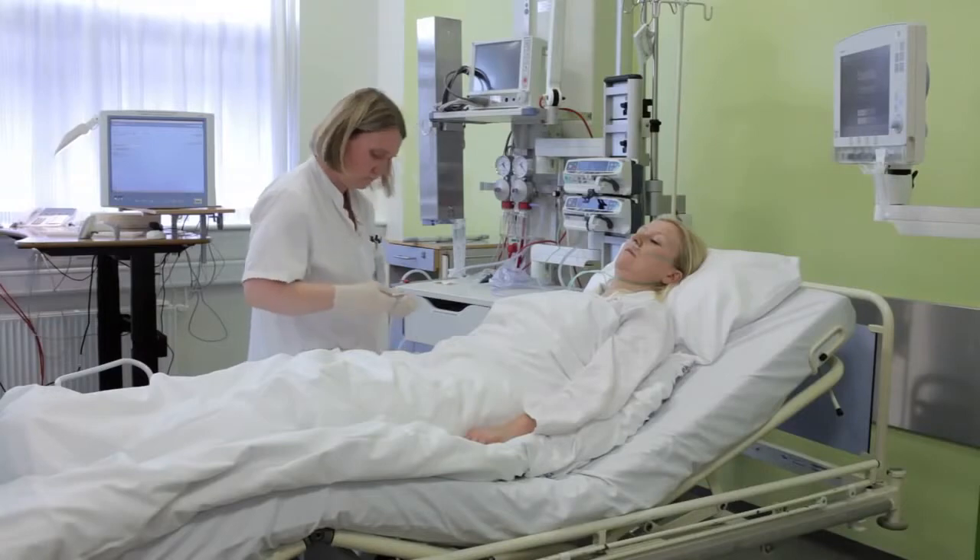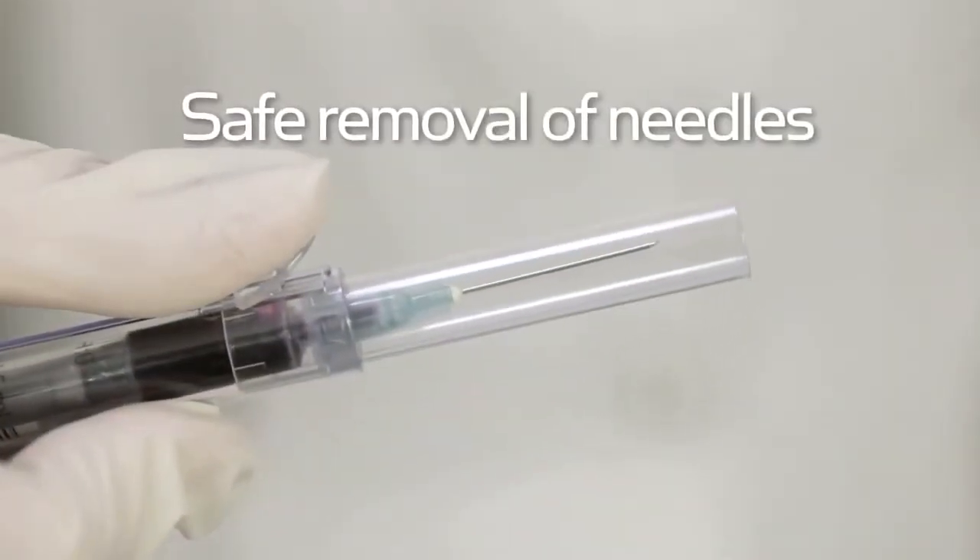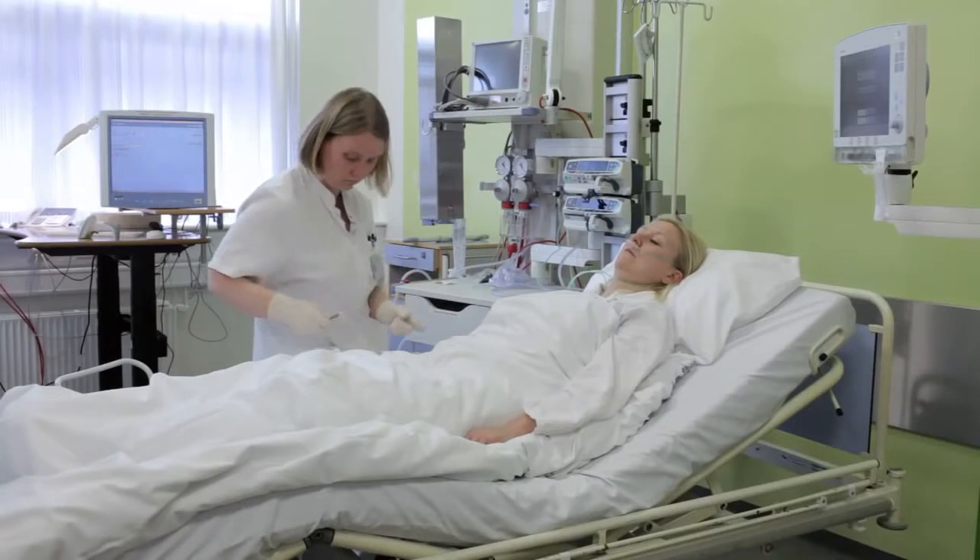The needle shield device ensures safe removal of needles, reducing the risk of needle stick injury.